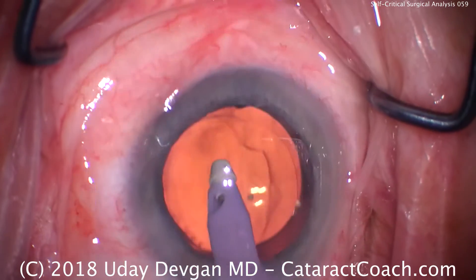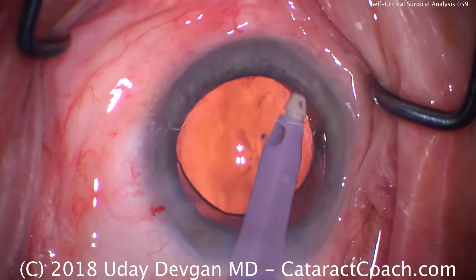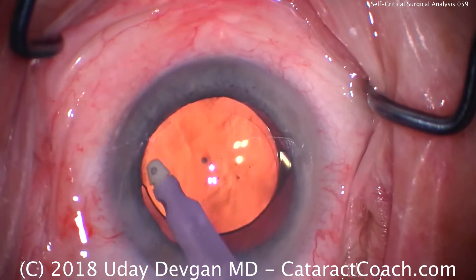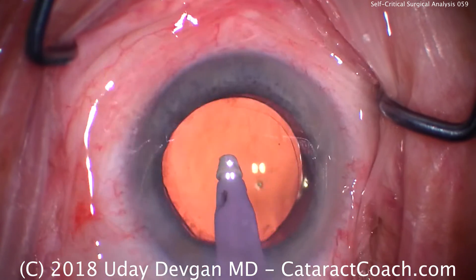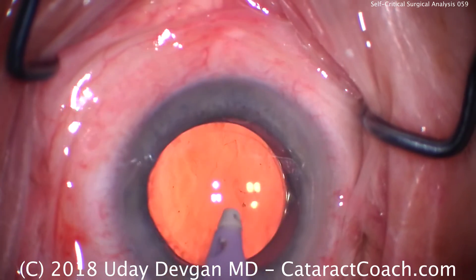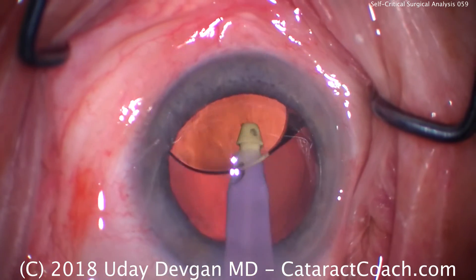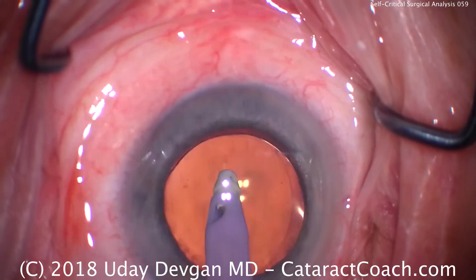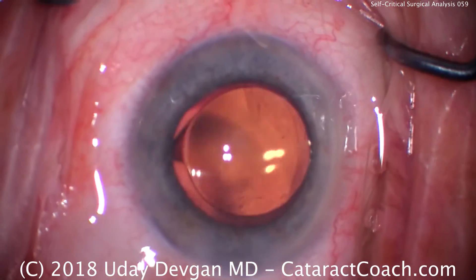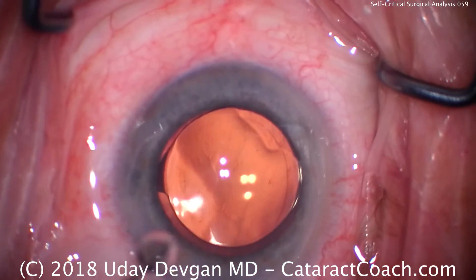This is a case where I wanted to show you what goes through my mind tens of thousands of cataract surgeries later. What do I think when I operate? I focus on the case, and then afterwards when I watch the video — I still record and watch my own videos; I may not keep them, but I certainly record them initially to learn from them — I think: what could I have done better? That little incremental improvement every step of the way is what gets you to being truly a master surgeon. A very routine case, but there are steps I could have and should have done better.